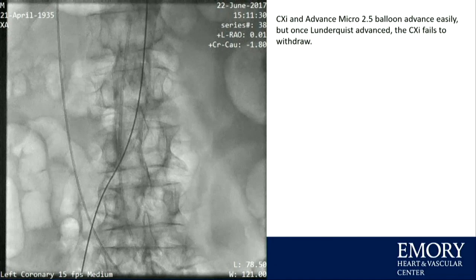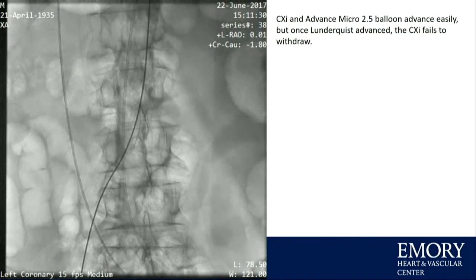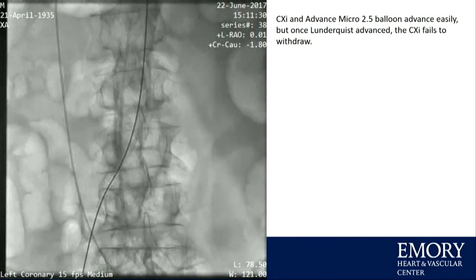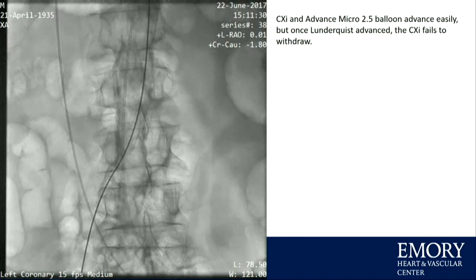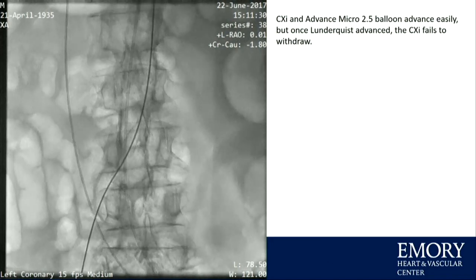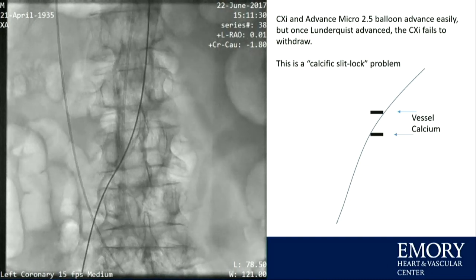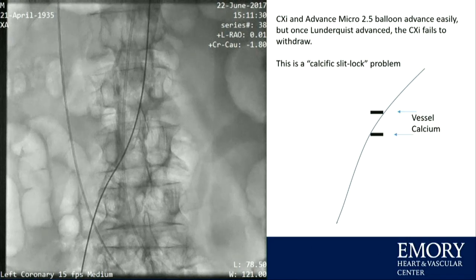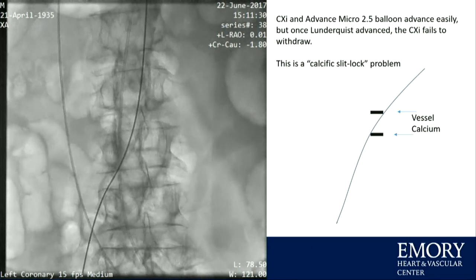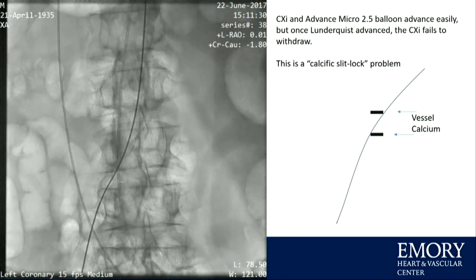But here's something very interesting. We put the wire through, we put the microcatheter through, we put a Lunderquist wire in, and here I am trying to pull the microcatheter out so that we can drive over, and you can see just the whole aorta moving. The reason is we sort of created a calcium lock, right? It's like handcuffs. In other words, the stiff wire bent things to the point at which the microcatheter is being locked by the calcium, since this is such a small window on the top part of some ectasia.